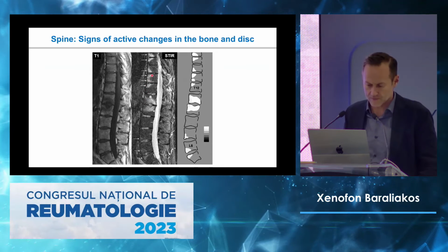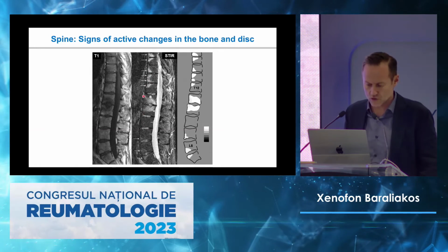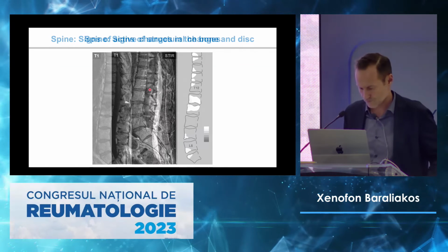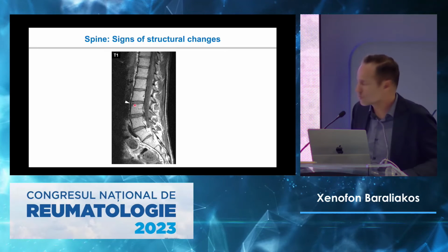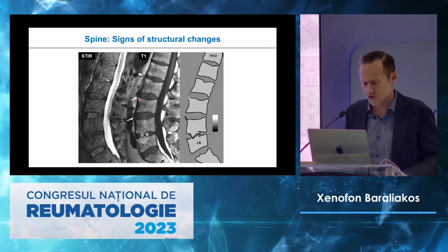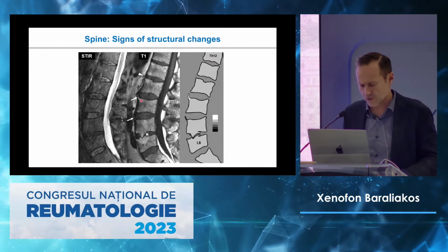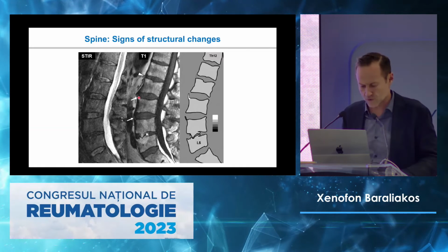You see that here. The typical osteochondrosis has a more horizontal course. And here a small erosion, although this is something you will not really see that frequently in MRIs, or syndesmophytes, although also here MRI is not the best tool for syndesmophytes. Mainly you see them when they are fatty because of the fat that shows them more prominently.